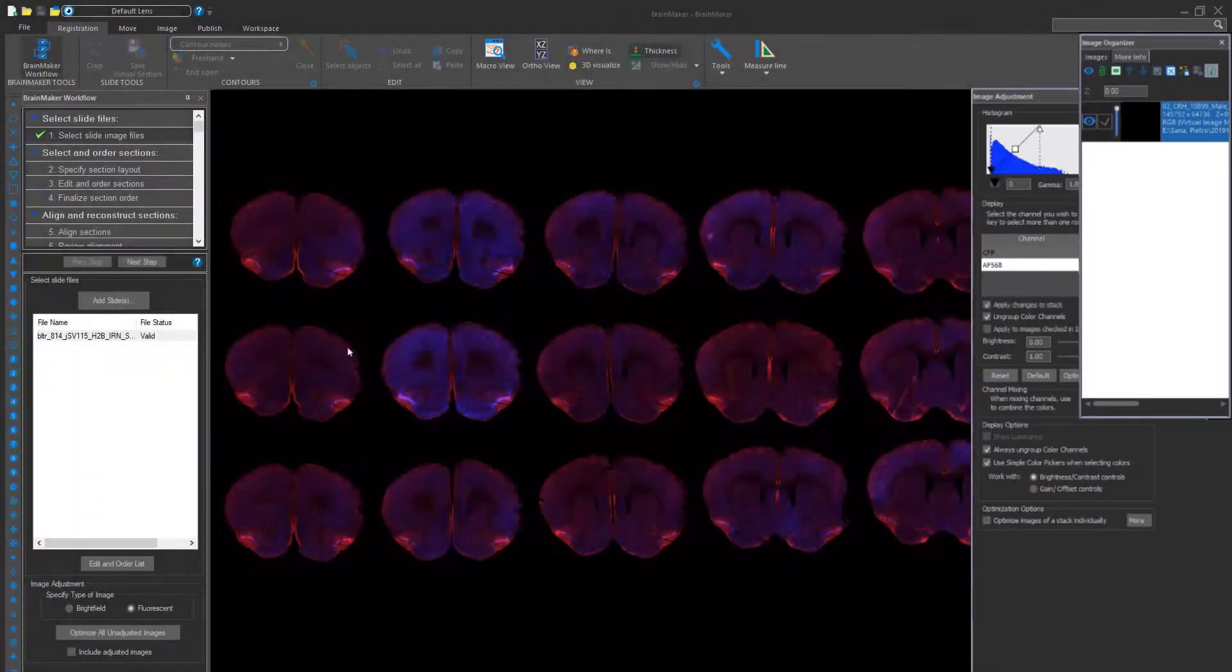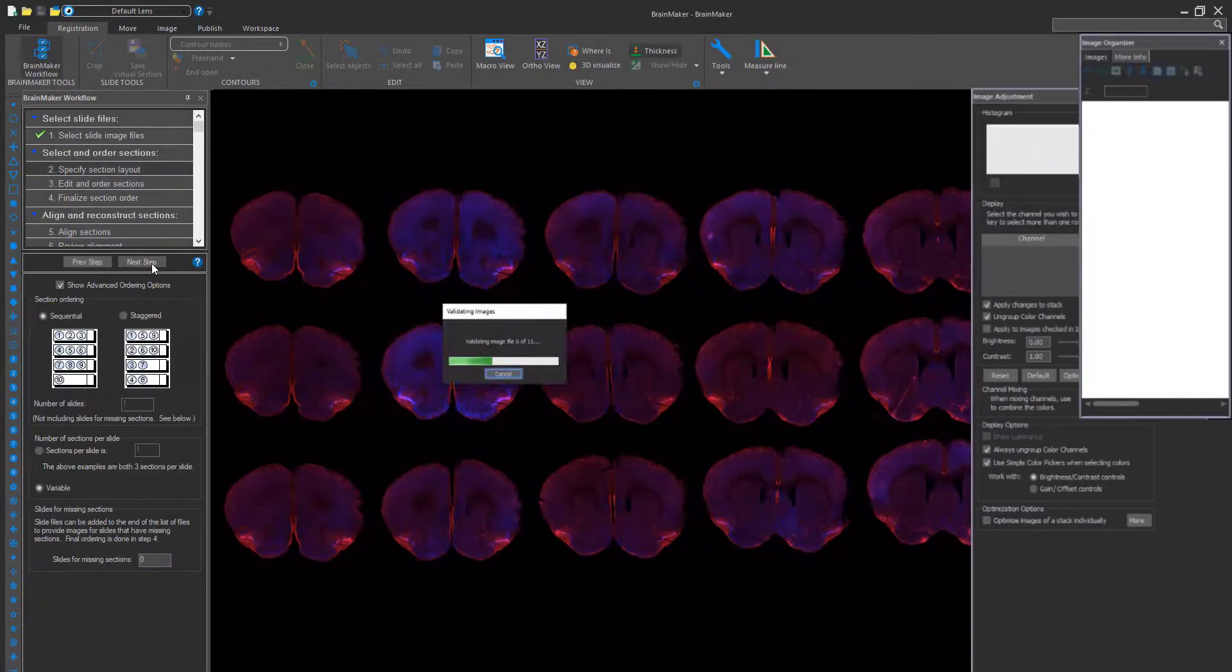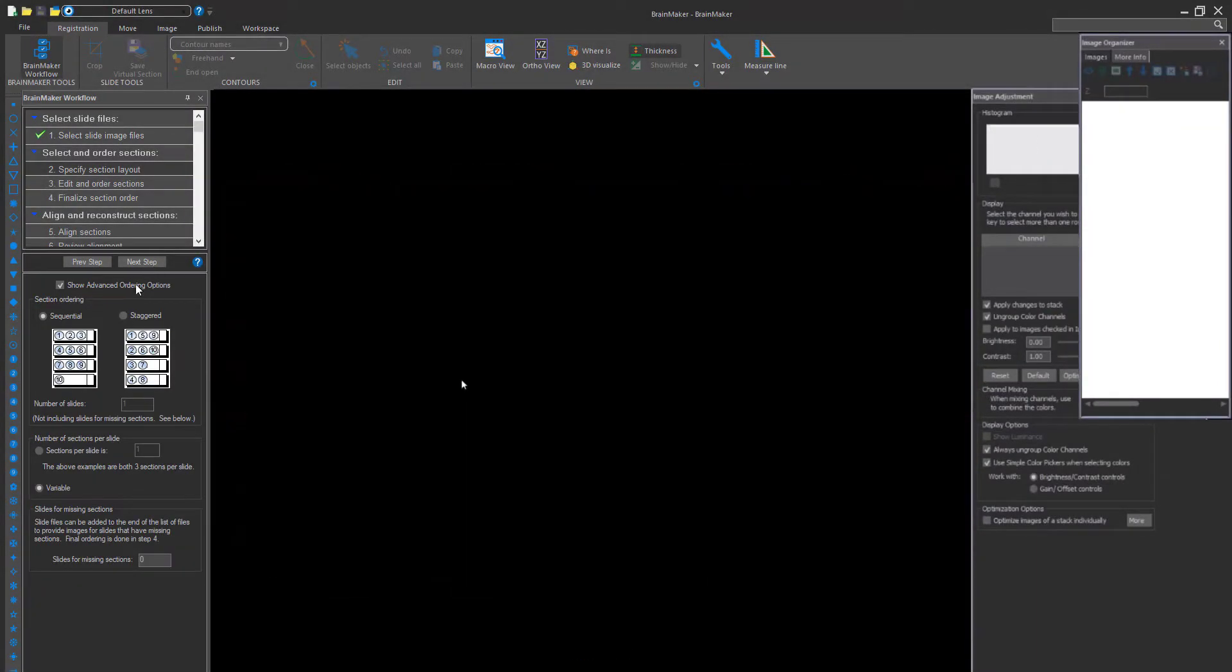Once BrainMaker has started, load in your whole slide images and specify the section layout. More than likely, you'll want to lay out the slides sequentially.